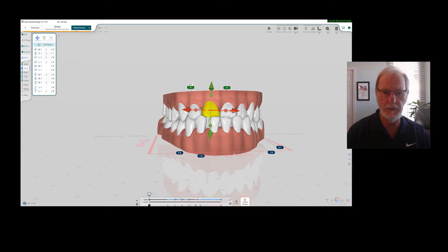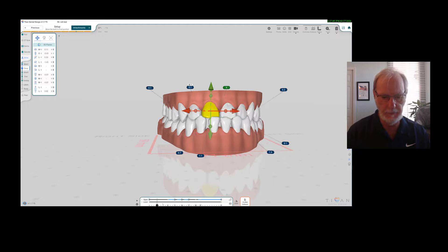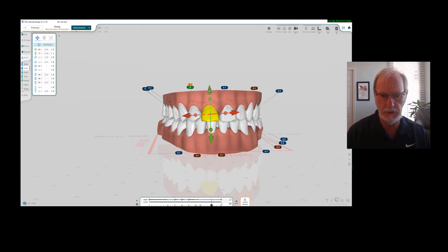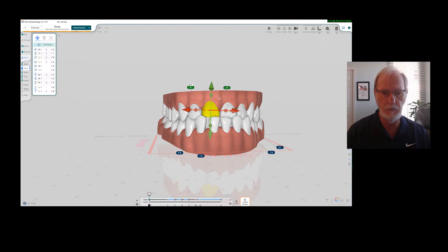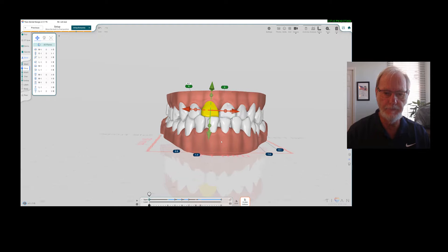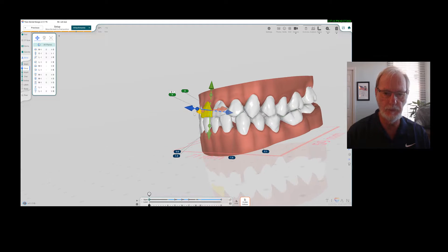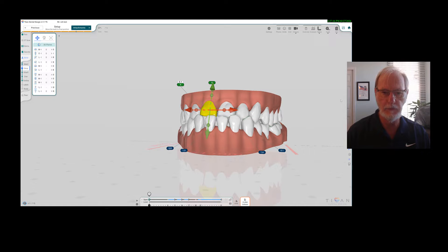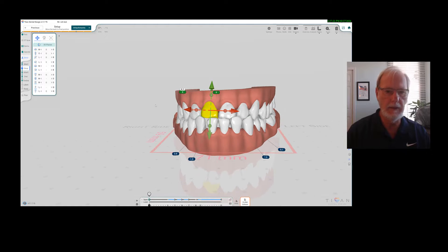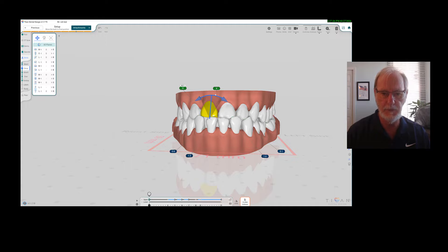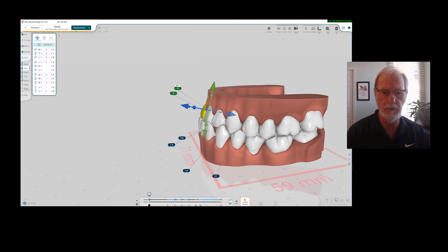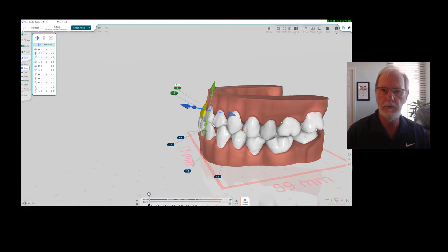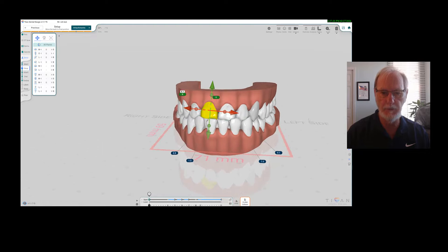It's the same principle as others, where you can move vertically. I already did it, so I can't really change anything. Sorry, you can move vertically, you can move to the side, mesiodistal, you can move buccolingual. If you click here, you can move, you can tip the tooth, and there are many other ways of doing things. This is the tipping. Obviously, if you go this way, you'll have the torque. All these are already incorporated.